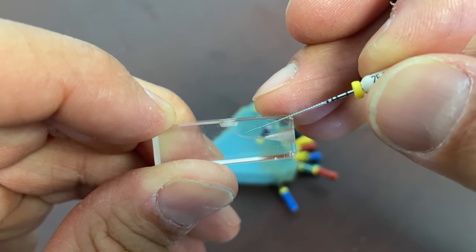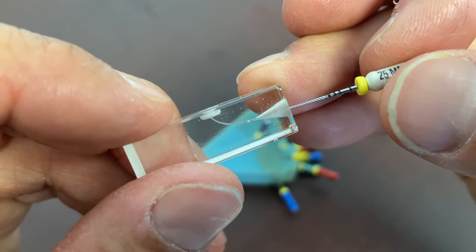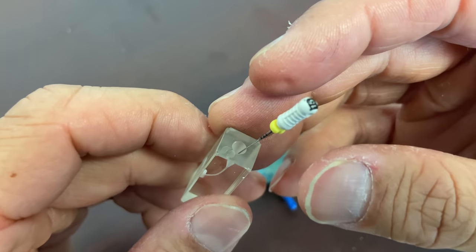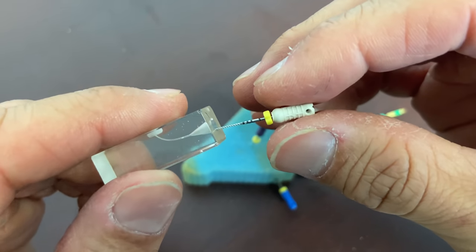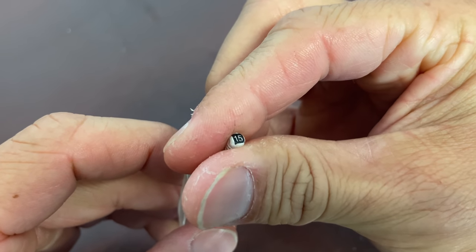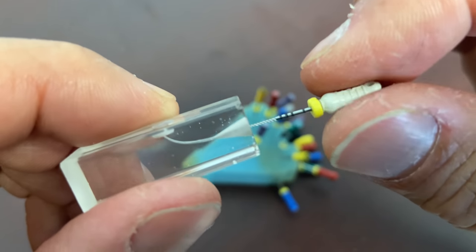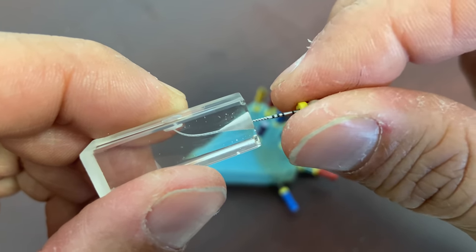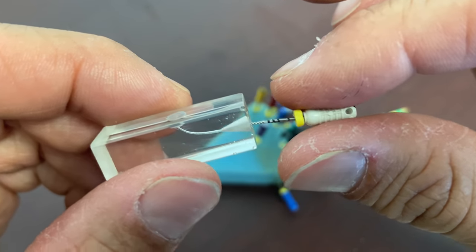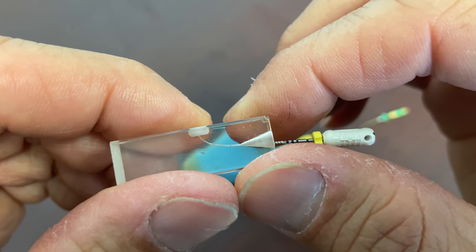We'll talk about the balanced force technique for getting around curves and also for large files when opening up large canals like central incisors. With a light hold on the file, as you watch-wind it will actually walk its way down the canal on its own. What will happen is the file will turn in your fingers and you'll have to reset and hold it further back.